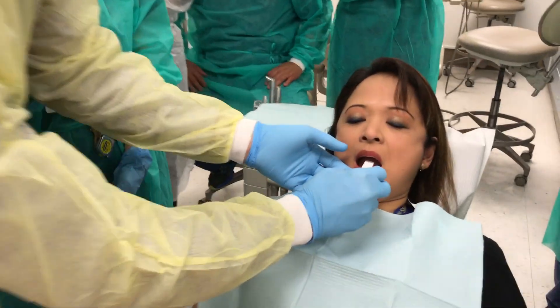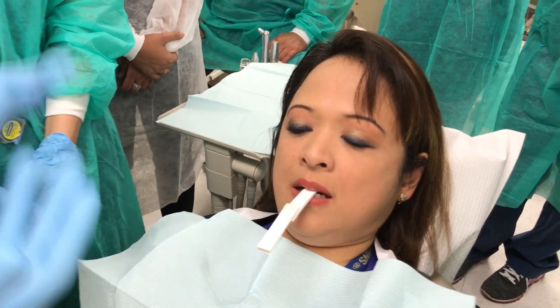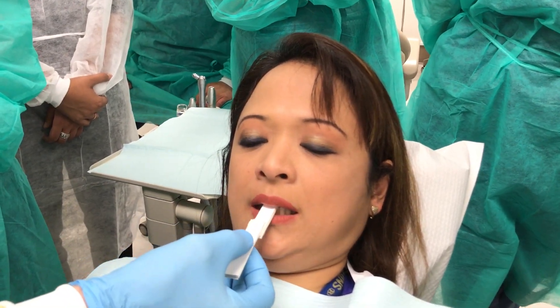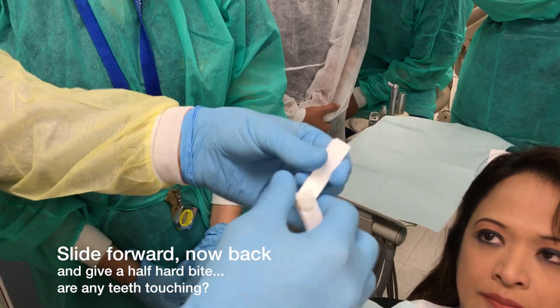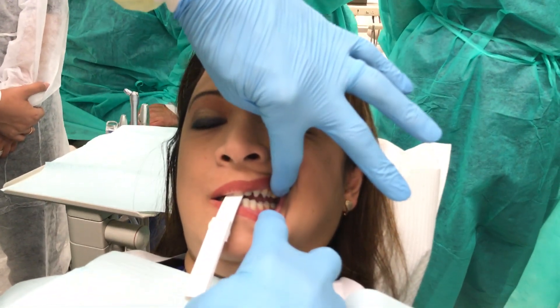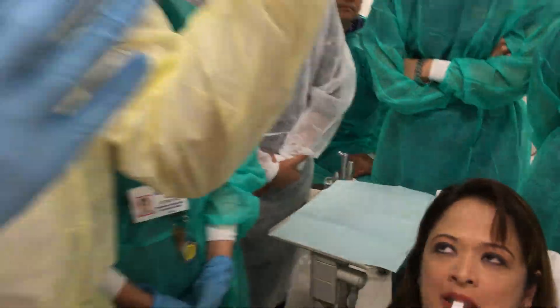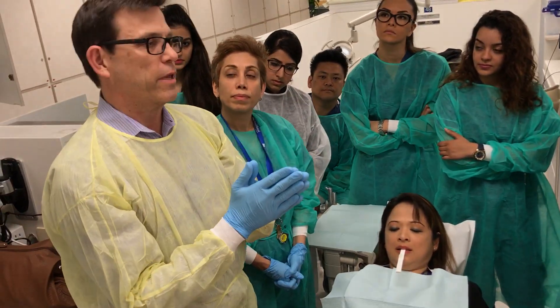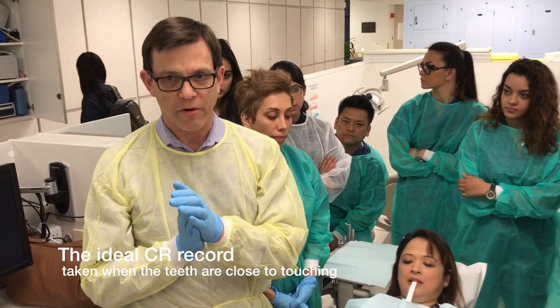Let's have you go ahead and bite together for us. Tina, I'm going to ask you the same questions every single time — I'm just trying to make sure we're on the same page. Bite together and slide forward and back, and give me a hard bite. Any teeth touching? No. Open for us. Now we're going to take out another stack of leaves. Bite together — you can see that none of her teeth are touching in the back. But you would never want to take a CR record at this position because she's too open. It's really important to have a centric relation record taken as close as possible to where their teeth are going to come together, yet have no teeth touch.